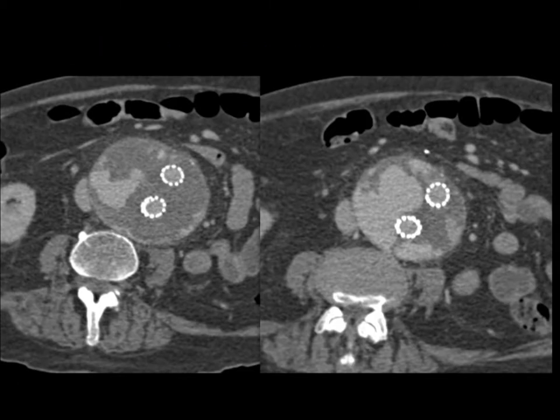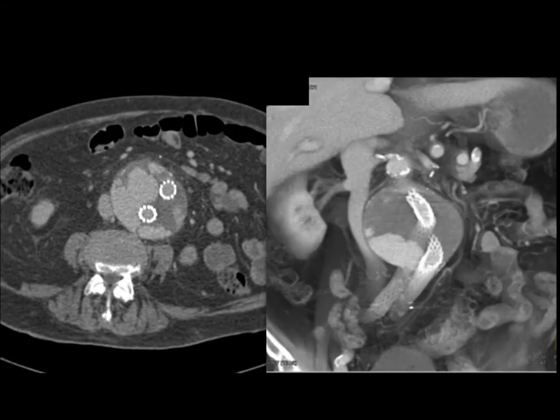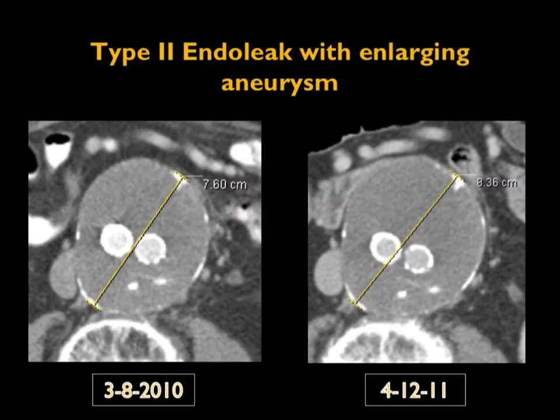Sometimes endoleaks are best seen on the arterial phase and sometimes on venous phase; most of the time they're seen on both. Sometimes they're only seen on venous phase because they're slow. You can see here this large aneurysm post endovascular stenting with a large endoleak. In this case the endoleak is present and the key point is the aneurysm is increasing in size from 7.6 to 8.4 centimeters in a year, so repair was done but intervention is needed.